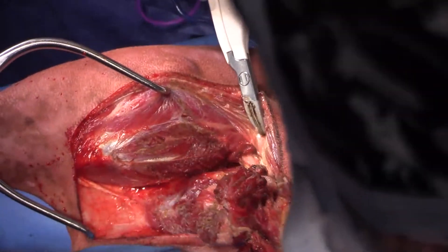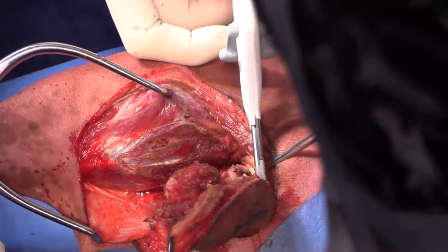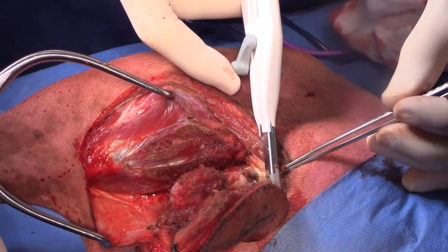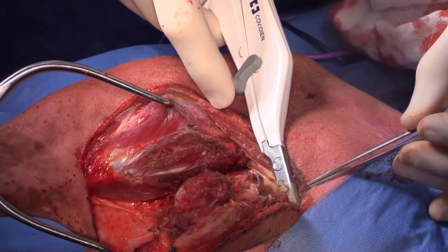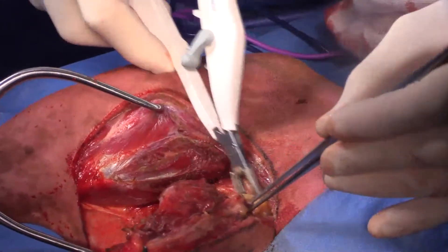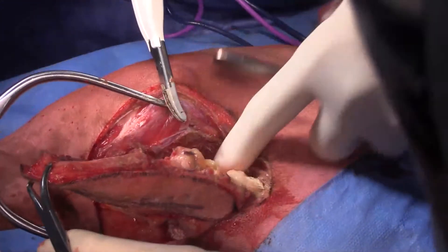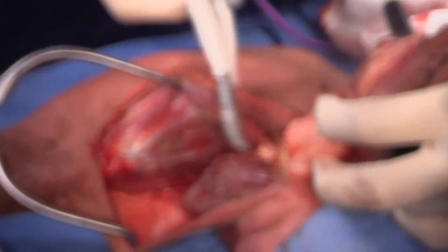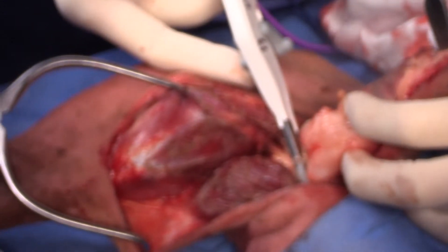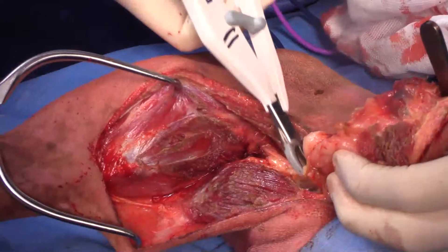There's a branch of sciatic nerve right there — I don't know if you guys can see that. That's a big branch of sciatic nerve, which would probably be going down to the gastroc muscle. There's a branch of it coming into the muscle that we've excised. Just watching out for that sciatic nerve there.